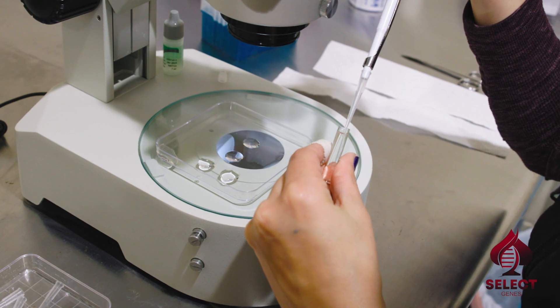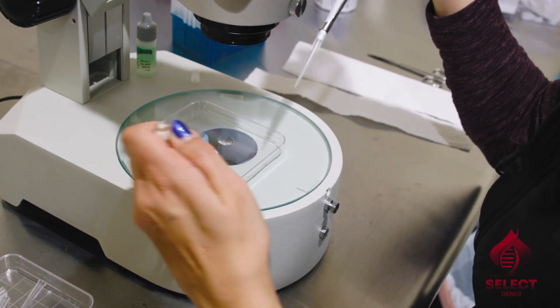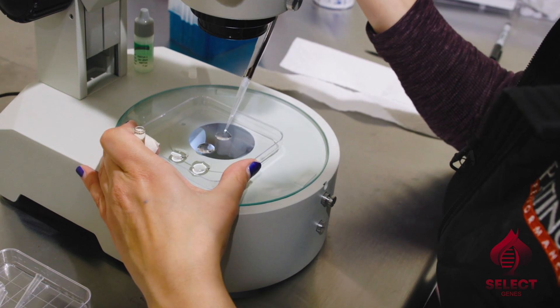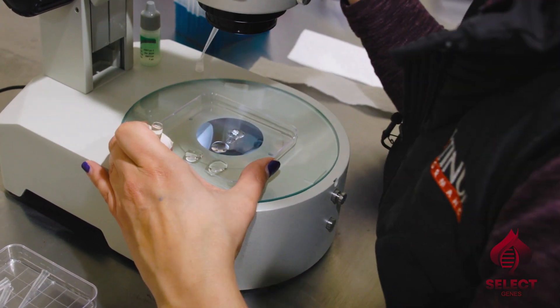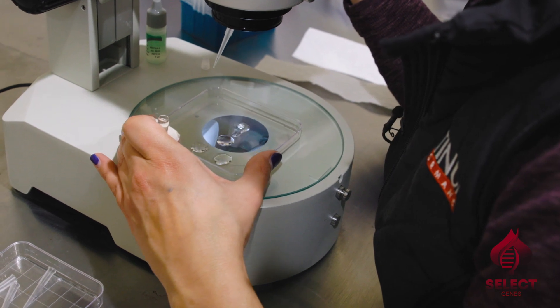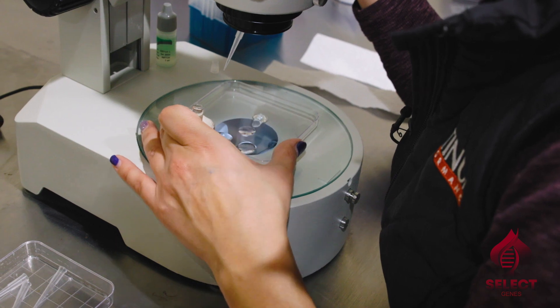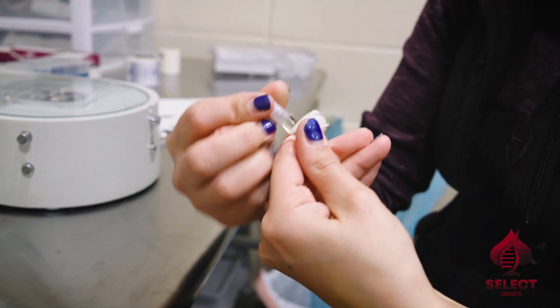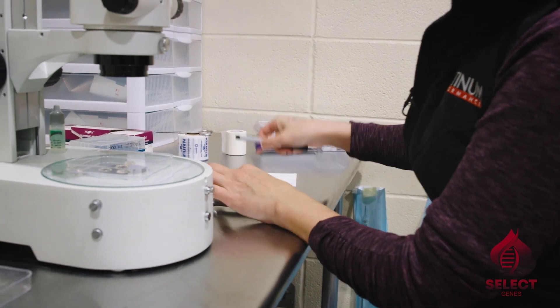We're going to go pick them all up under the microscope and put them all in our little shipping vial, wash a couple of times. Since they're microscopic and hard to see, we're going to go back and rinse really well here and take a peek and make sure that nobody decided to stay here with us at the Lazy E — because we want everybody to go on to the lab to be successful.